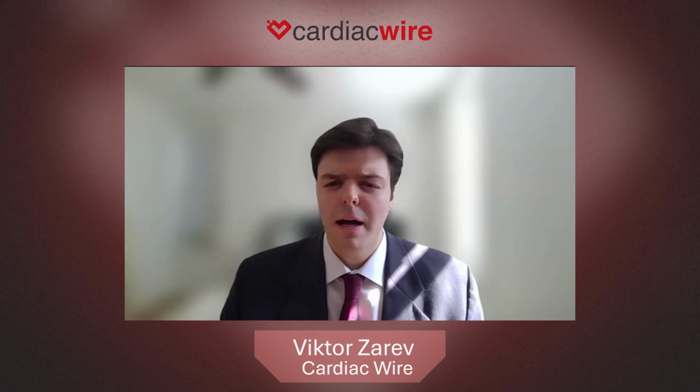Going a little bit more on the technology side from our audience here, we have a question. Have you used any AI algorithms with the Arineta scanner that you have in office? And could you give maybe the clinical use cases about that? Yeah, we sort of described all of those in both of our presentations, but we have Clearly, which is an outstanding plaque analysis program that tells us the severity of plaque, the volume of plaque, and as that example we saw earlier from Dr. Morales, you can actually follow the progression or regression of that plaque. It also has an ischemia tool that'll tell you whether the patient has, in a binary way, ischemia or non-ischemia.